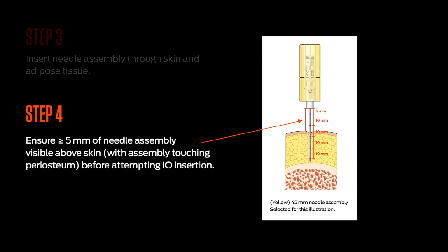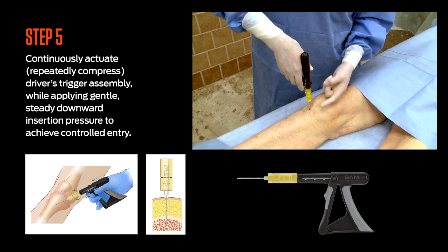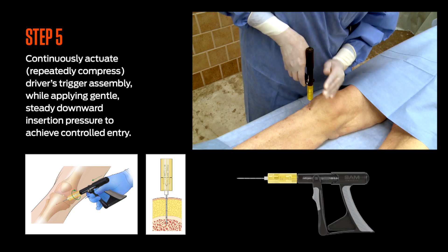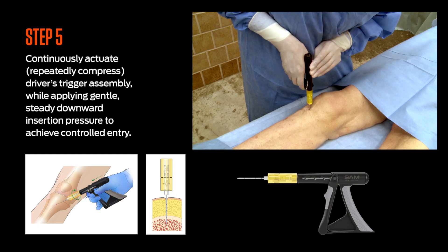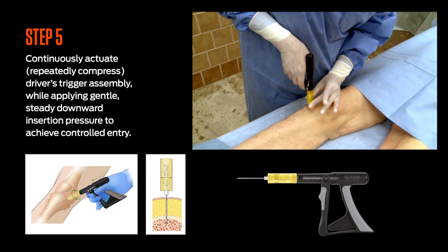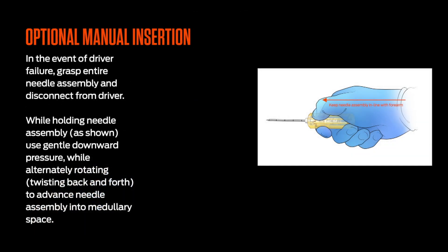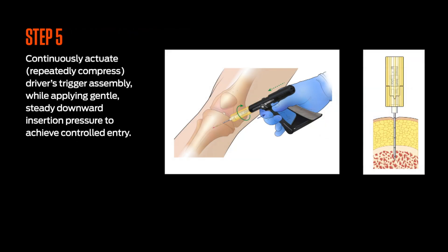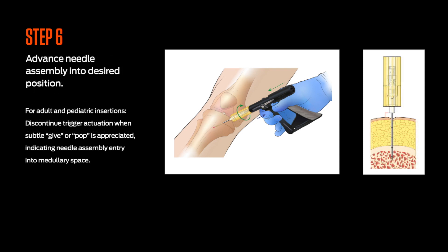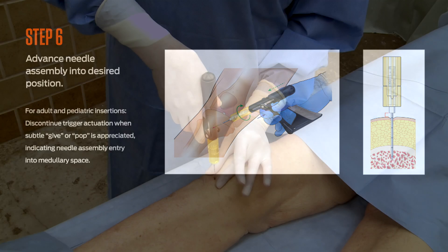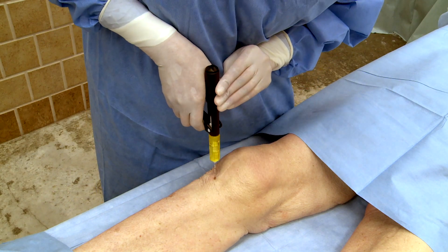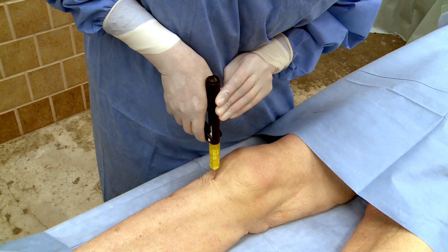It's important to reiterate that needle assembly selection is based upon overlying tissue depth at the insertion site. Step 5: Continuously actuate or repeatedly compress the driver's trigger assembly while applying gentle, steady, downward insertion pressure to achieve controlled entry. It's important not to use excessive force — use minimal, gentle downward insertion pressure allowing the needle assembly tip's rotation to penetrate the compact bone. Step 6: Advance the needle assembly into the desired position. For adult and pediatric insertions, discontinue trigger actuation when a subtle give or pop is appreciated, indicating needle assembly entry into the medullary space.